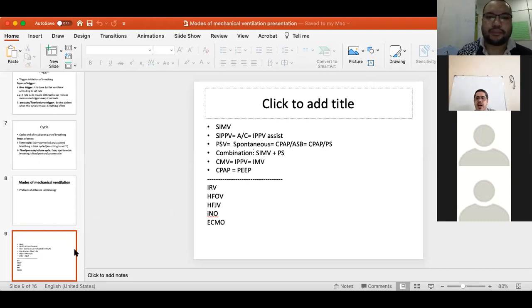So let's go to the slides. We'll go one by one. After that, we apply them on the whiteboard. Let's go to SIMV, first one. Next slide.